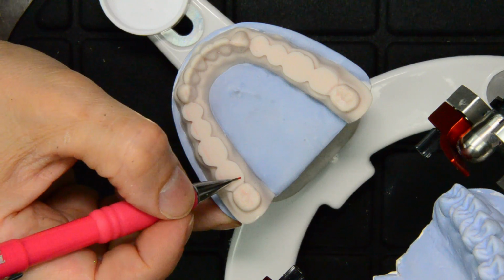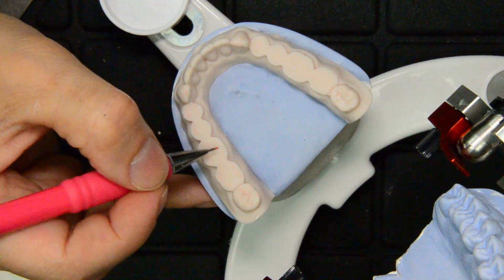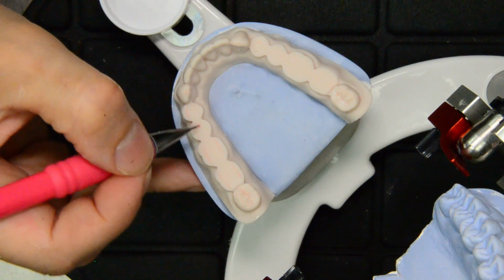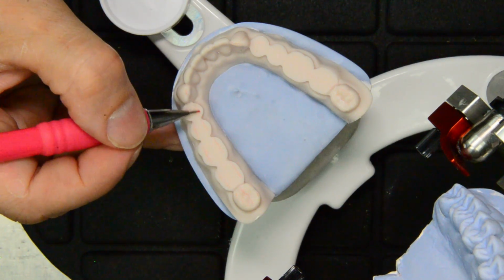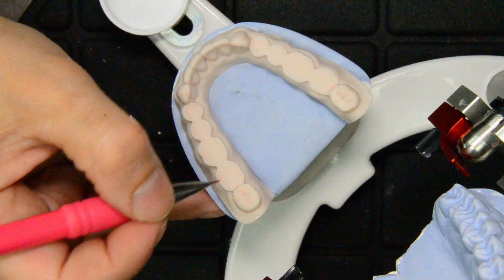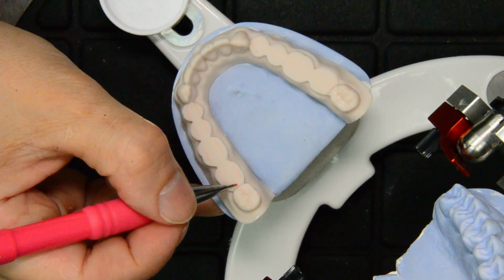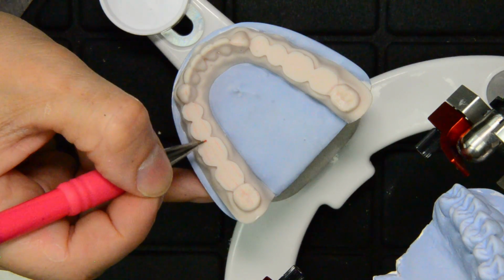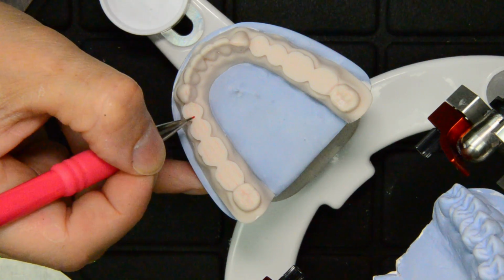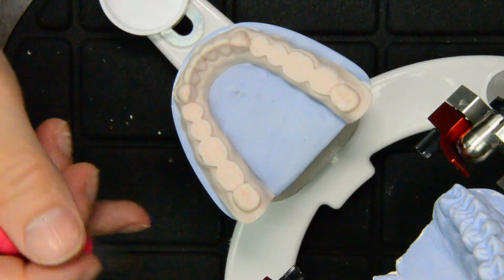Then we'll do the lingual reference line according to the lingual cusp tips, and the fossa reference line according to the fossa, and the center of each tooth as we get to the canine.